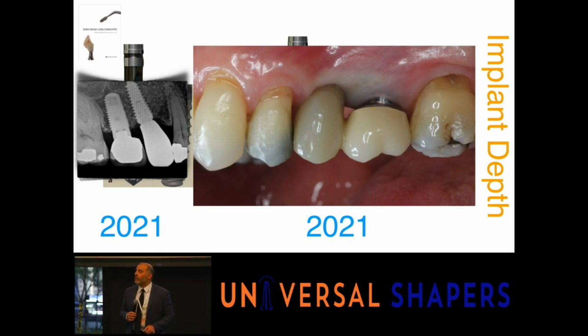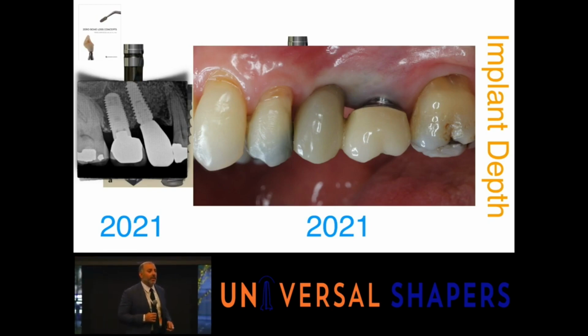So that component starts to change dramatically. And this is what we typically see. And this is at the point where we start to say, can I add some more porcelain? What can I do here? Do I have to change my abutment? Do I have to make a ridge lap type of design now to try to accommodate for this loss of soft tissue?